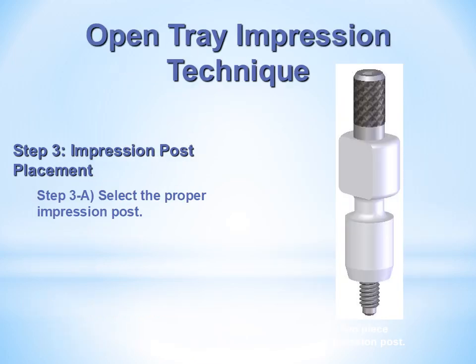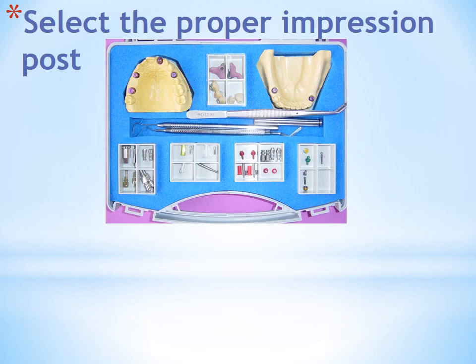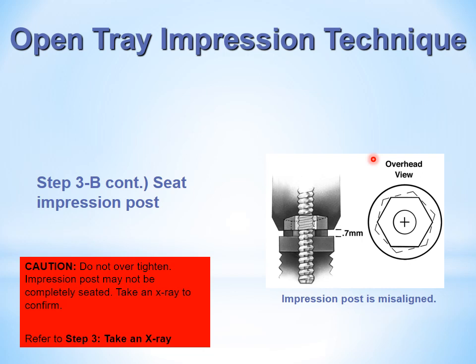If not, and the healing is good, so we go to select the impression post. Select the proper impression post, and also we seat the impression post inside the implant and then take the X-ray to be sure that it is fully seated inside the implant.